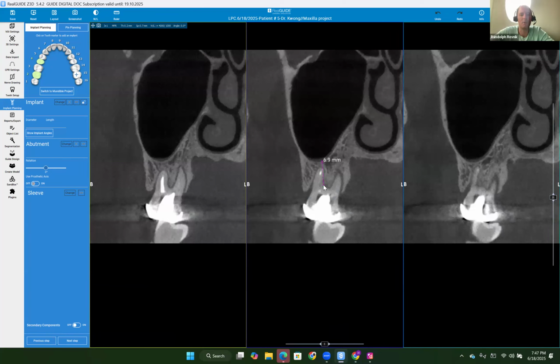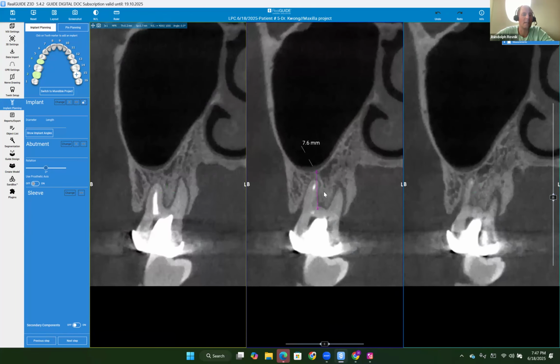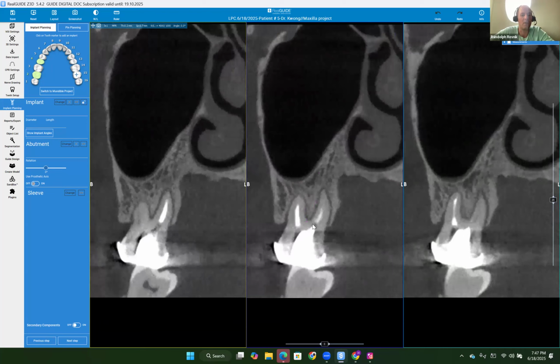If you're able to maintain the majority of the bone, you'll have about 8 millimeters, so you'll be able to do an implant via either an SA1 or SA2. So she won't need a full lateral wall. It will be a little bump if she does want to replace that tooth in the future. So I would definitely do that delayed, where you take it out, socket graft it, and in about 4 months, come back and we'll take a new CBCT and plan that.